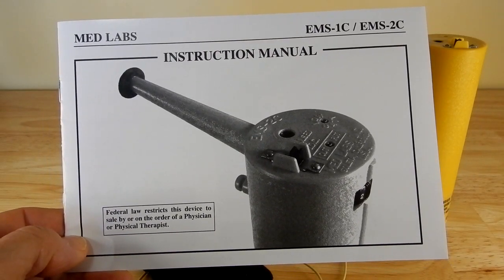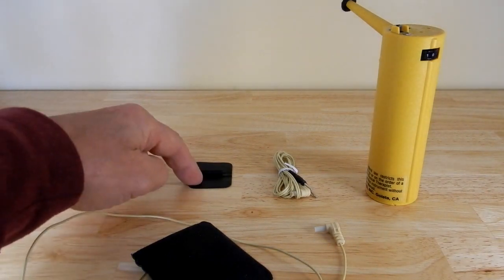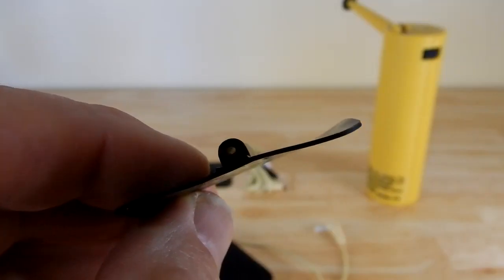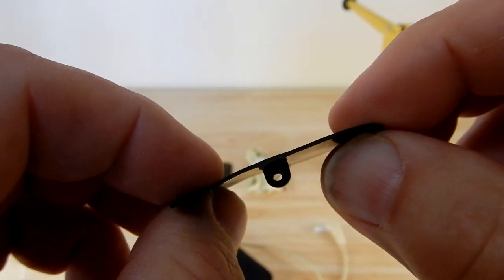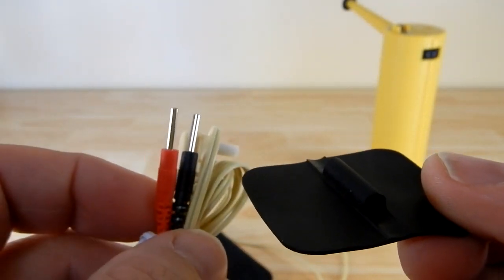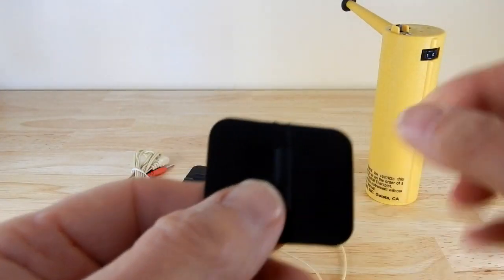You do get an instruction manual. You will also get two conductive rubber electrodes and the accompanying cable that you would need to use with those. Here's a close-up of that conductive pad. You would put either one of the red or green plugs into the hole there, and then the other end goes into the port on the top side of the unit.